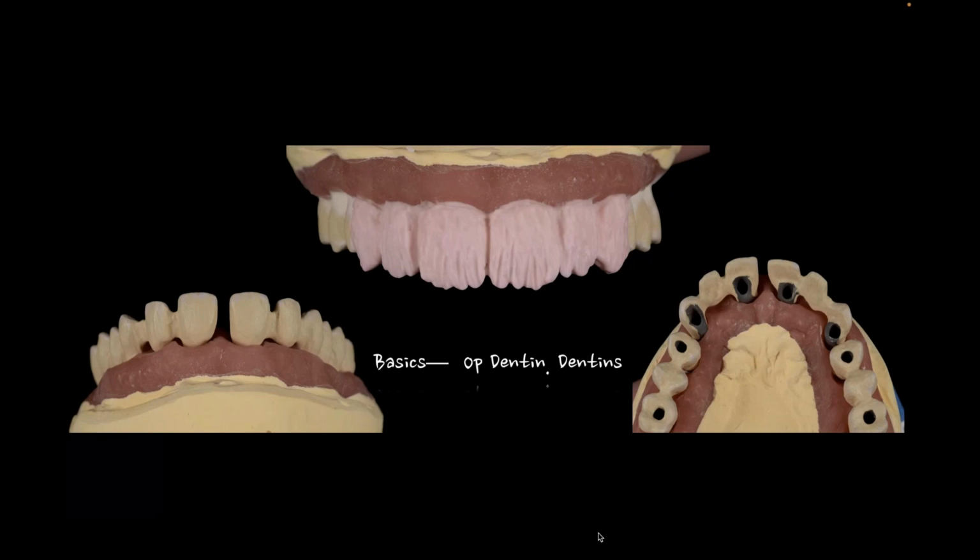Some of you might be thinking, why did I use metal ceramics for this? For me, when it goes to implants and connector sizes, I still think metal ceramic is a much better way to go across the board. It doesn't mean I use them for every case, but on certain implant cases, I'd say a percentage of 40-50% of my implant cases that are kind of involved like this, I'm still going back to metal ceramics because I feel like I can get the best strength, the best functionality with the flexibility of the metal, the best aesthetics, and have the most amount of space to work in and have the most amount of support for the implant itself.